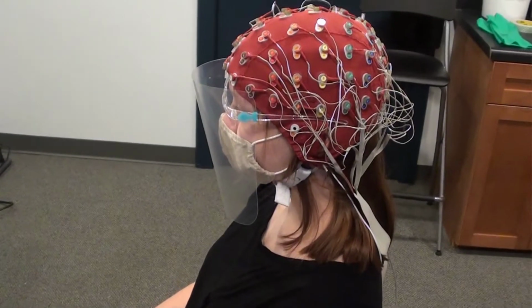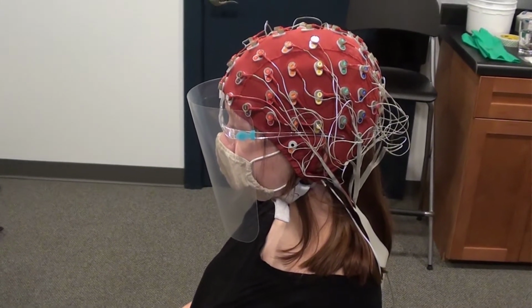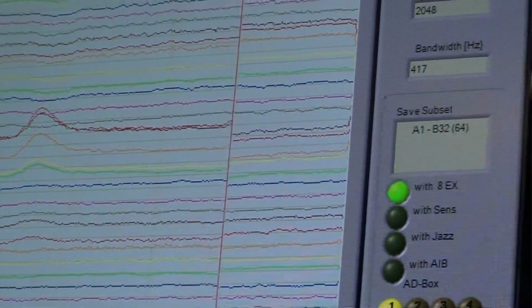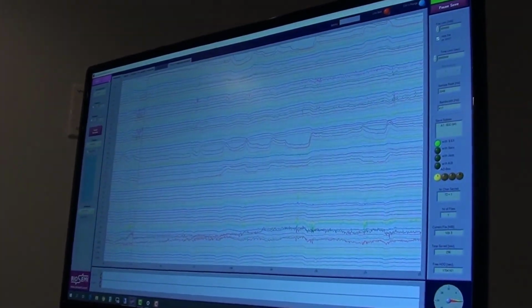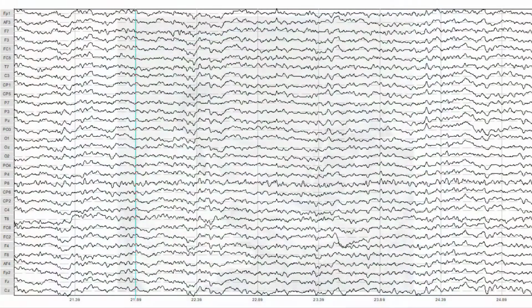As a side note, some types of interference of concern when recording EEG come from the body itself, including the heartbeat, eye movements, EOG, and muscle activity, EMG. For the moment, set these aside, since this technique using the gaussmeter will not help identify or minimize these sources.